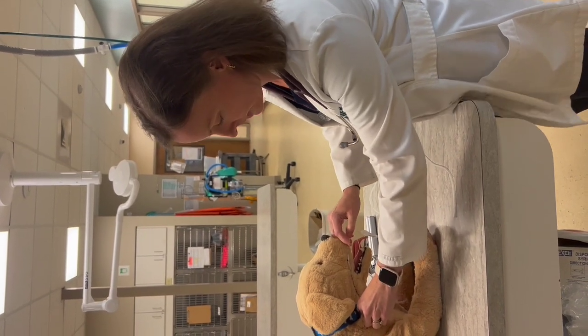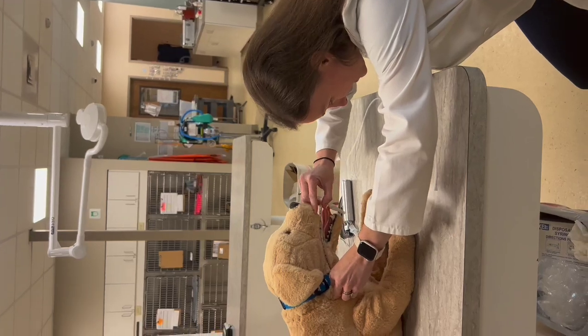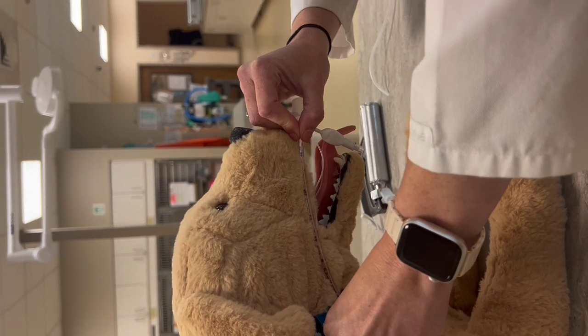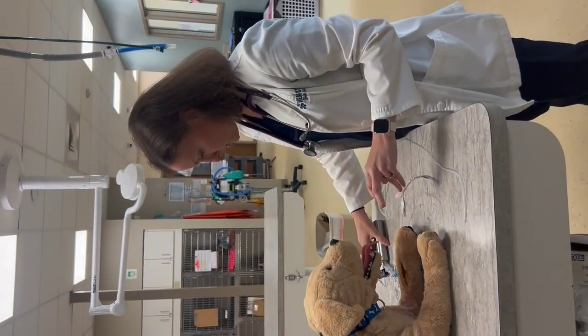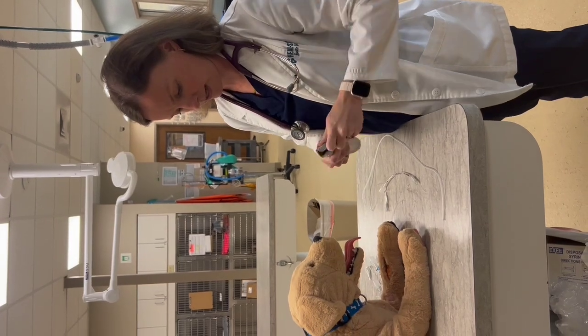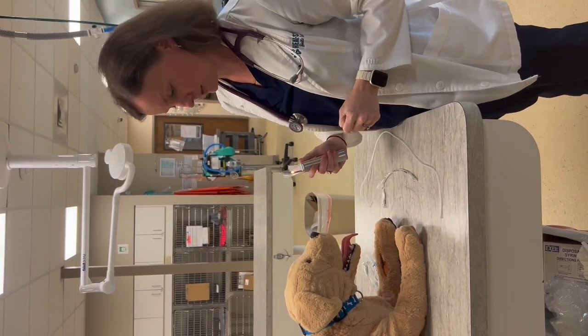I look to see where the canine tube matches up with the number on the tube and then I remember that. For him, that's going to be about the 17, so I just remember that for when I place the tube in. Next, we're always going to use the laryngoscope — he's going to need the bigger one — which gives us a light and better visualization.